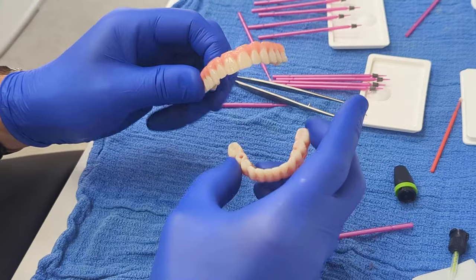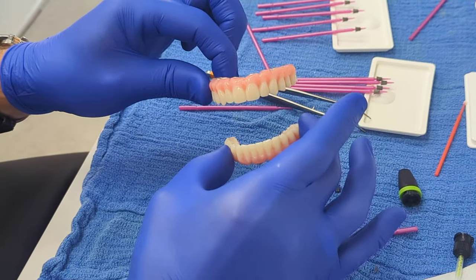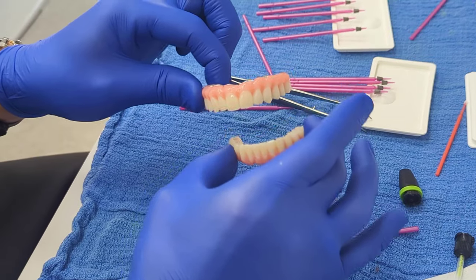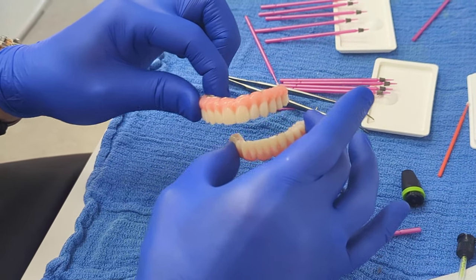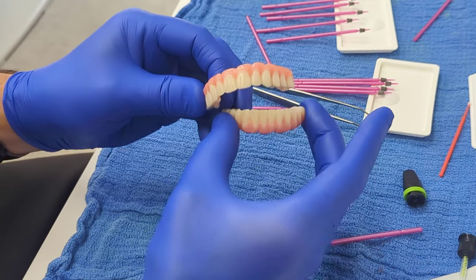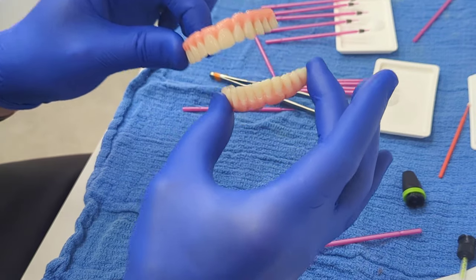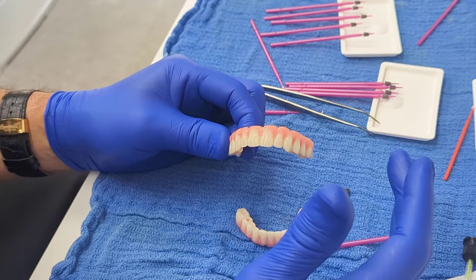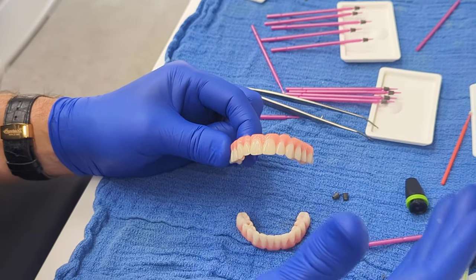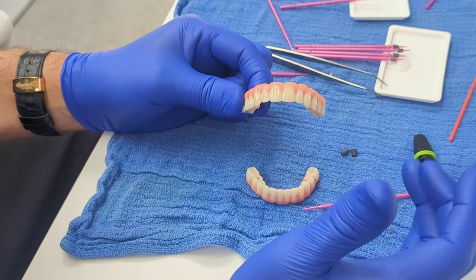We overcompensate and we add a little bit of material thickness here to resist those fractures. But at the end of the day, when you have an upper and a lower, and these do not move, there is no proprioception, there is no ligament that makes them move, you are going to have more wear and or chipping of the incisal edges on a Gen 4 than you will on a zirconia. So in fact, there's one disadvantage to the Gen 4, and I could probably tell you 8 or 10 advantages of the Gen 4.